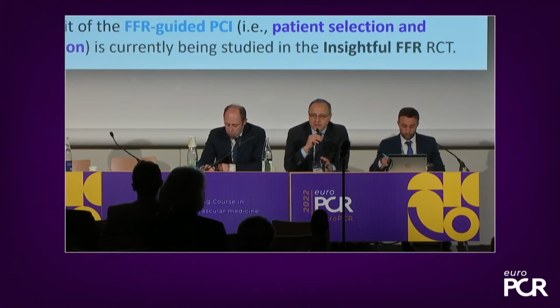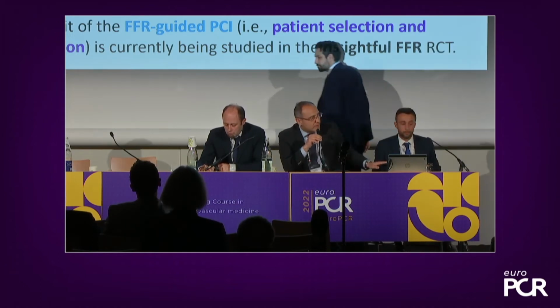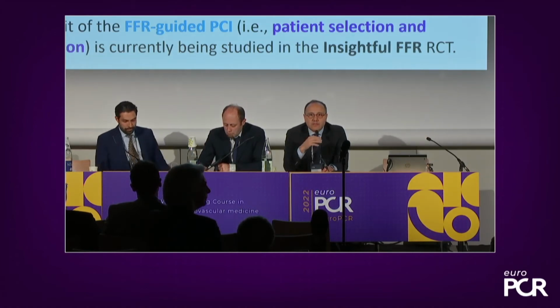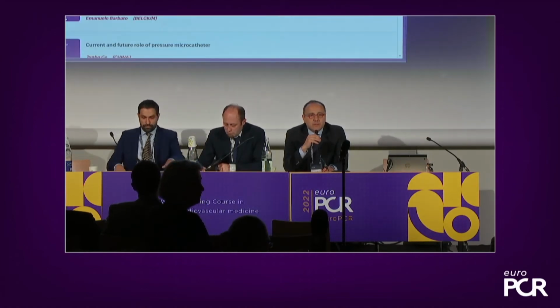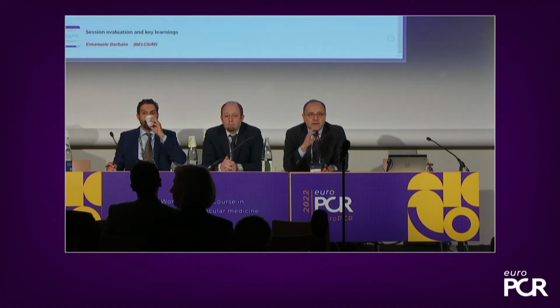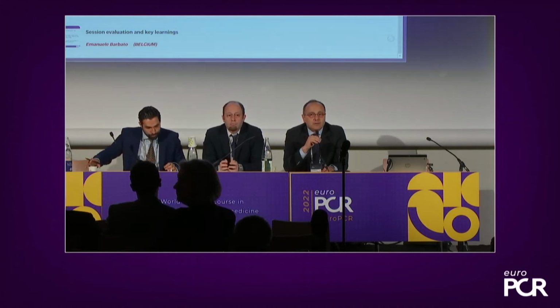Please join us here at the desk, and perhaps while Emanuele is getting ready for the clinical case, let's just try to understand what our practice is here in the room, and let's inquire on the way you use intracoronary physiology in your patients. By show of hands, I'd like to ask you, how many of you in the room, when assessing physiology, would rather do a single point measurement, just pressure wire down, and you measure resting index, hyperemic index, and how many of you do on top of this also a pressure pullback?